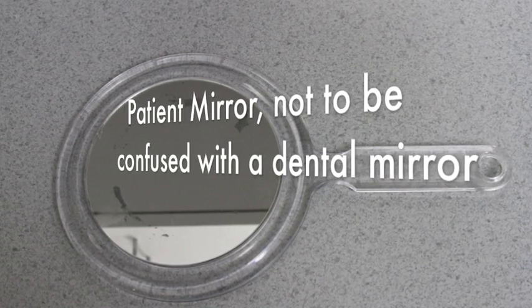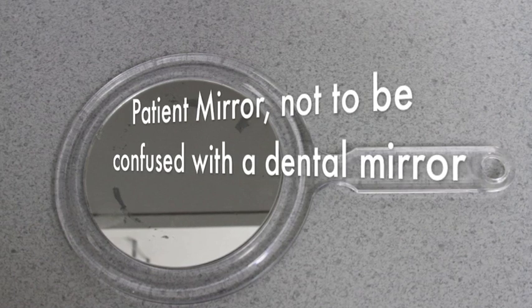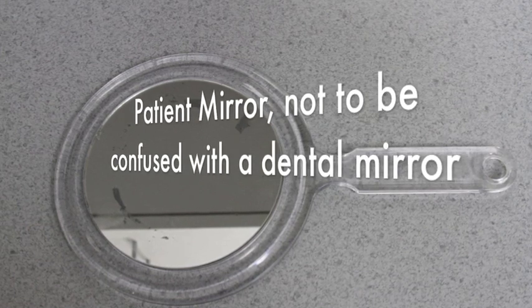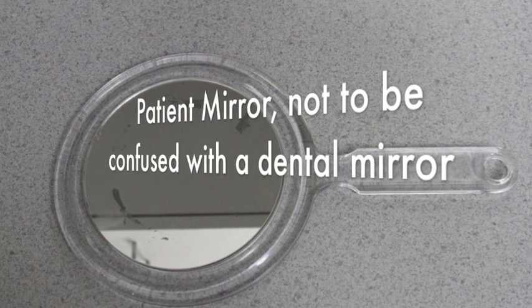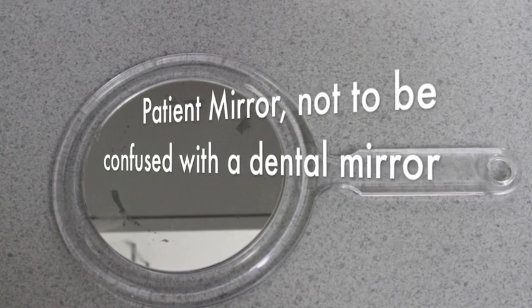From time to time, the dentist is going to want the patient to be able to see things in the mouth. When they do, they're going to ask you to give the patient the patient mirror, and they should not be confused with the dental mirror, as you can see here in this example.